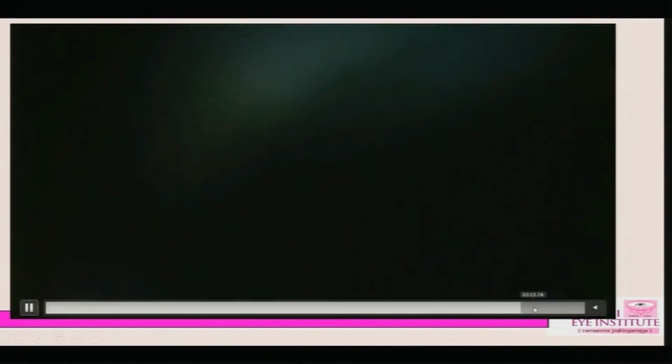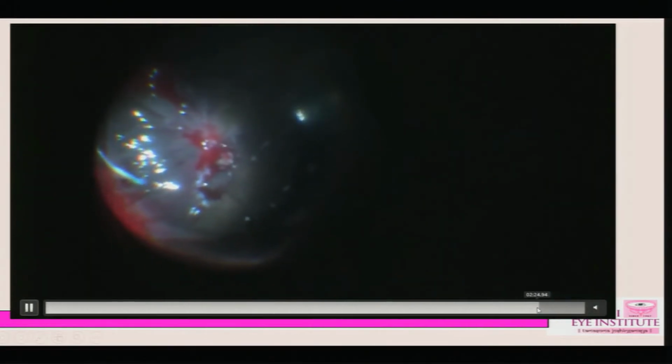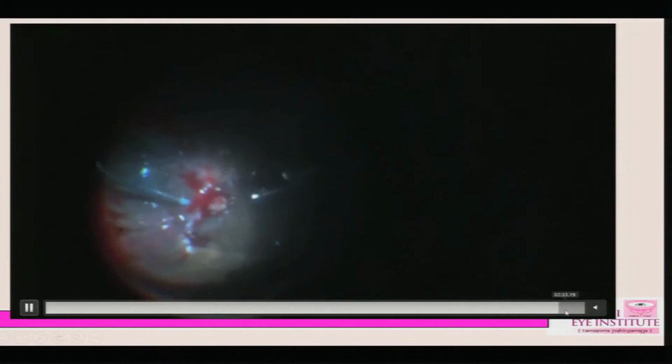And as you all know, if we leave the gas without removing all these membranes, then the PVR gets accentuated very fast and tries to complicate things more. So the next thing was to deal with these membranes very carefully and look at the anterior PVR there. We tried to slowly remove most of these membranes, doing a little bit of vitrectomy, but ultimately we had to do a retinectomy at the end where the retina was incarcerated into the choroid, and then did a nice fluid air exchange, PFCL exchange, then lasered this retinectomy, and the boy is doing well.